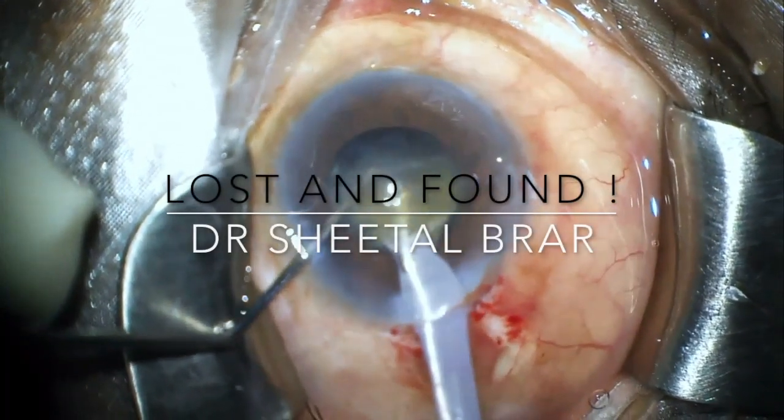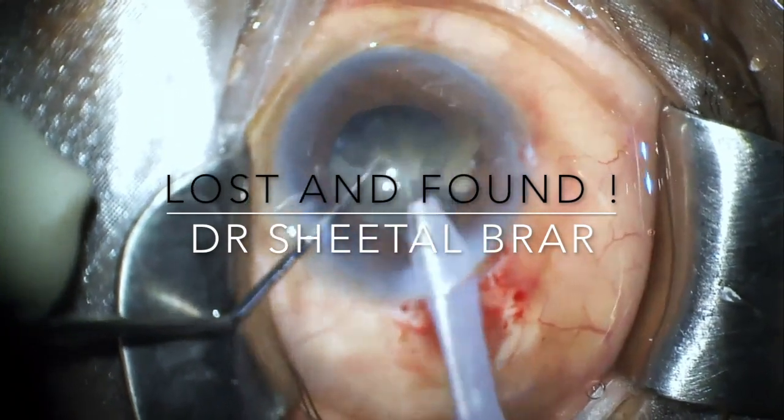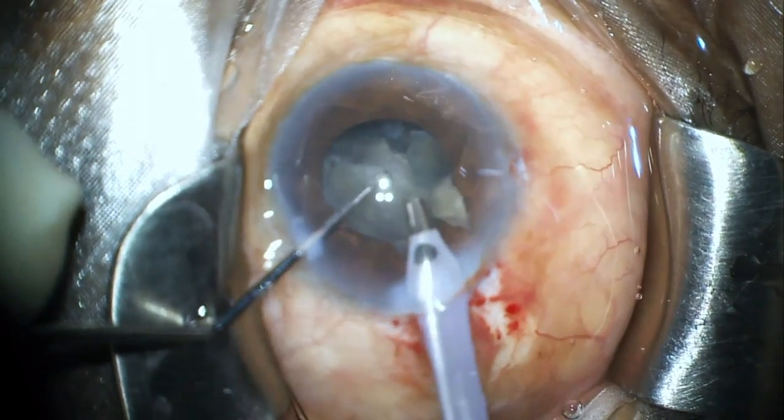Hello friends, just sharing this interesting case of a 66-year-old female patient who had a mid-dilating pupil due to pseudo-exfoliation with a grade 3 nucleus sclerosis cataract.